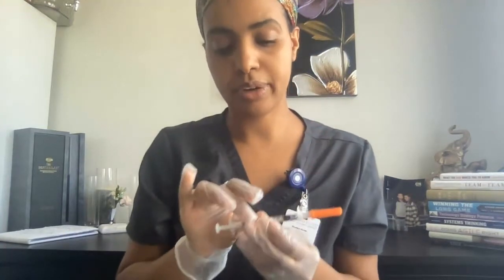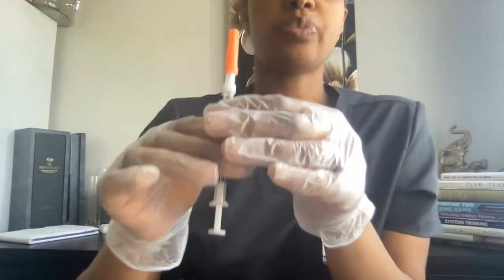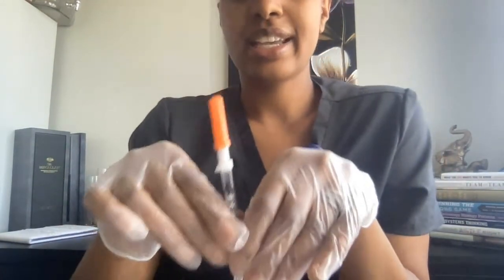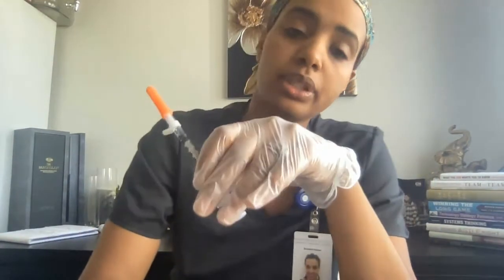If you're not preparing it at the bedside, label it, and then take it to the patient with you, and make sure you verify again with the patient before administering. If insulin is away from the patient side, we label it with the name and the dose, so we don't have any medication error.